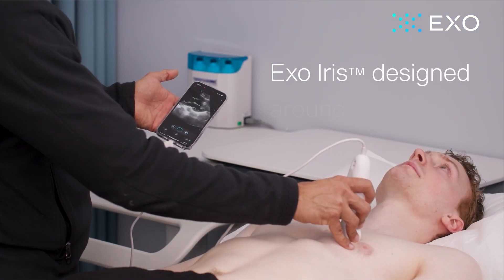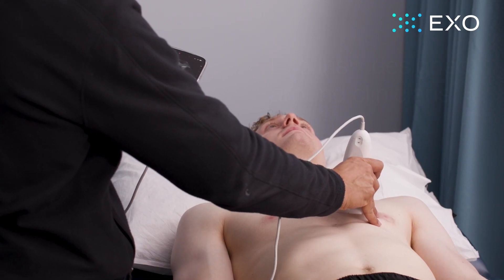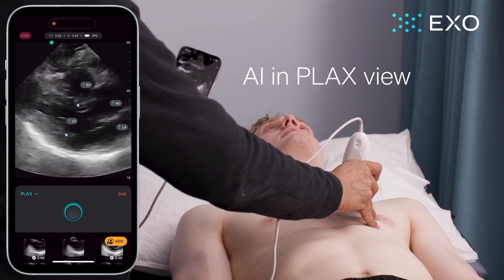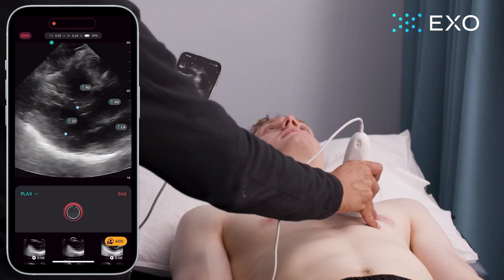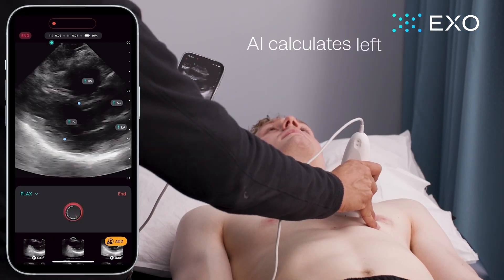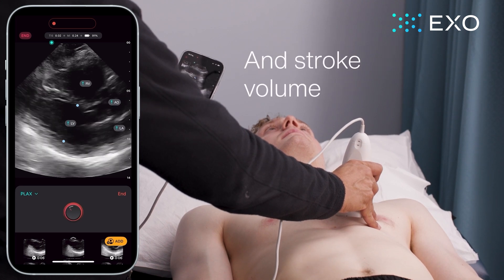User-based design based around the clinician. So right away, when I turn on the AI in PlaxView, it begins analyzing the image. Once I have a good view, I click a button, and the AI calculates left ventricular ejection fraction and stroke volume.